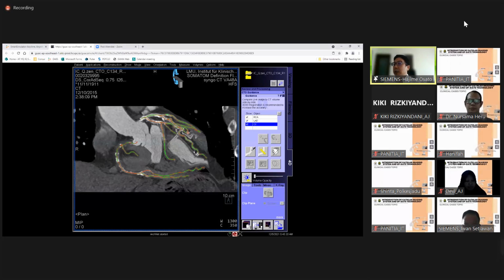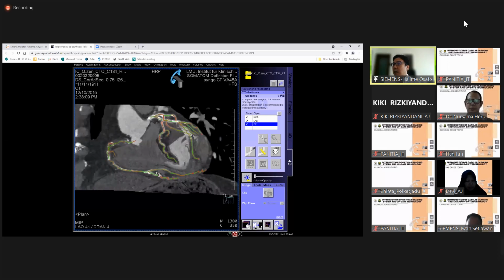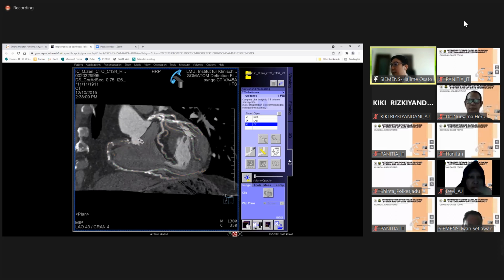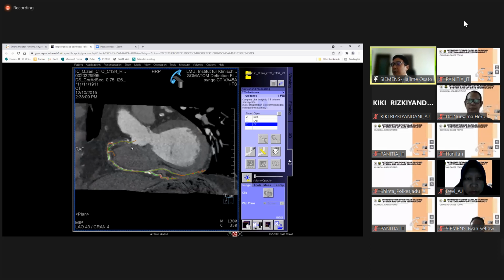If you change the angulation like this, the vessel color also changes. And for example, hide all objects, so we only see the calcification image, something like this. Now I focus on the RCA region, so that's why only the RCA region is shown.